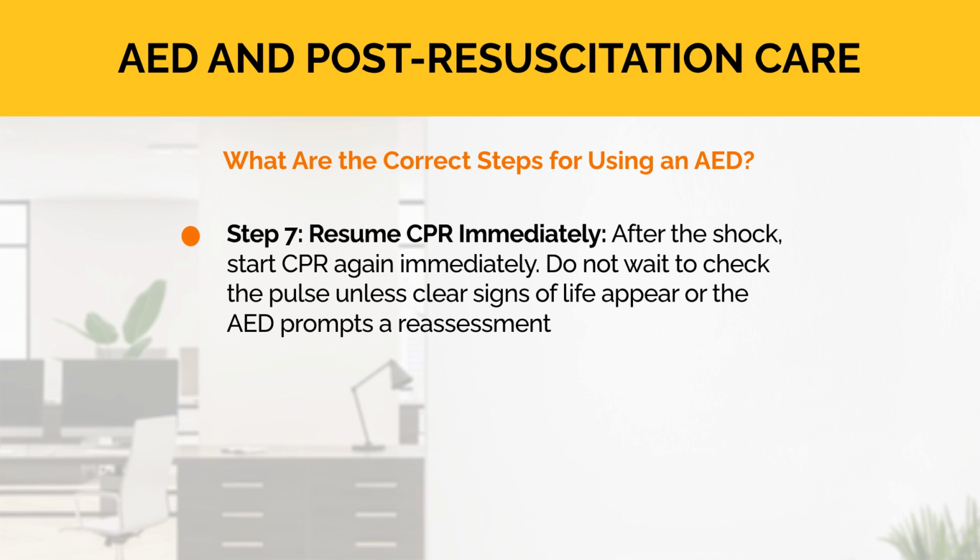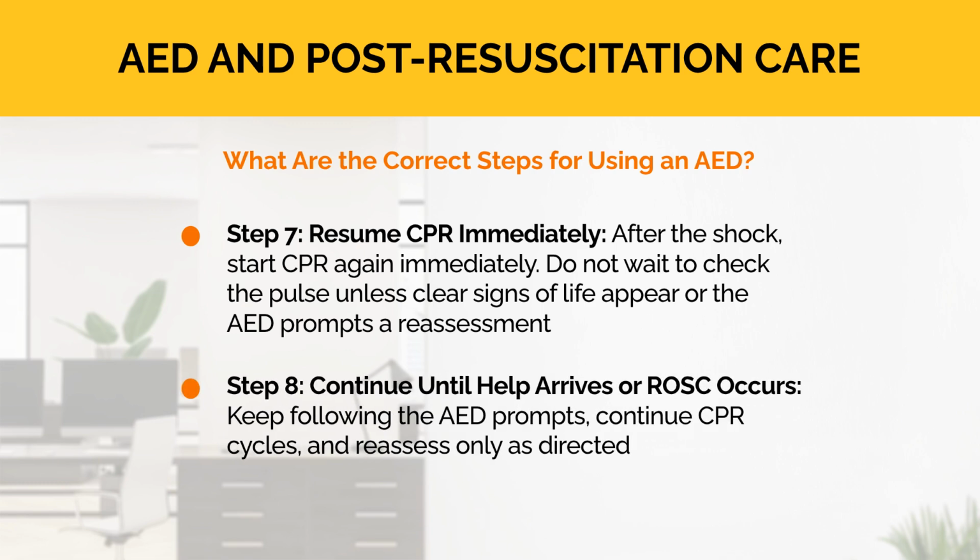Step 7. Resume CPR immediately. After the shock, start CPR again immediately. Do not wait to check the pulse unless clear signs of life appear or the AED prompts a reassessment. Step 8. Continue until help arrives or ROSC occurs. Keep following the AED prompts, continue CPR cycles, and reassess only as directed. Note: AED use should interrupt compressions as little as possible.